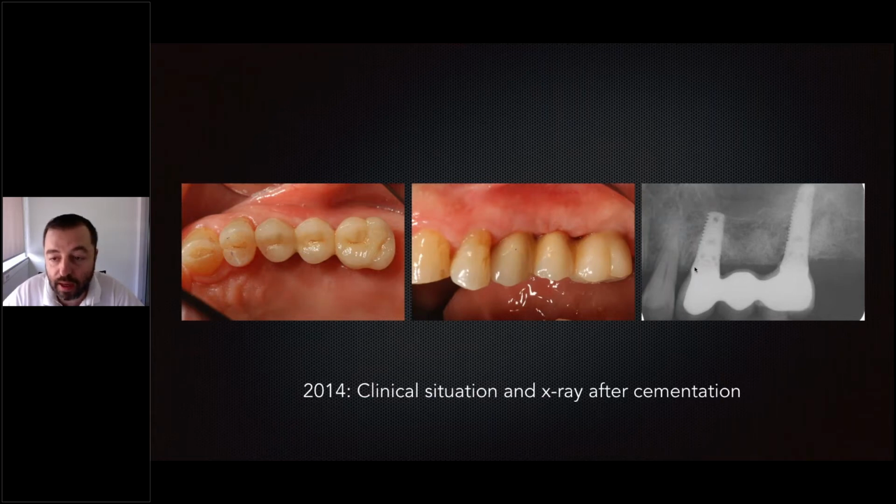And you can see how nice the outcome of the bone is here. We can see the bio-oss, how it was left there, and the level of the bone that we had on the 2-4 remained for the entire arch distally to that.